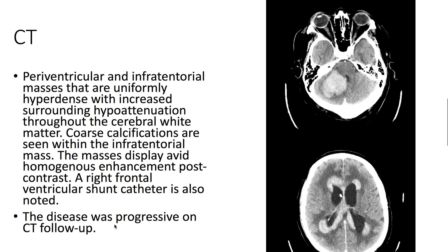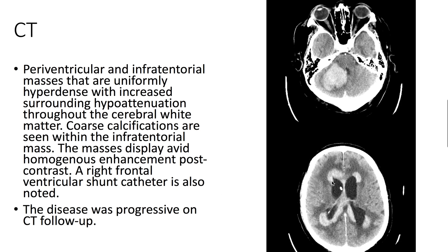On CT, we see periventricular as well as infratentorial masses that are uniformly hyperdense, with increased surrounding hypoattenuation.